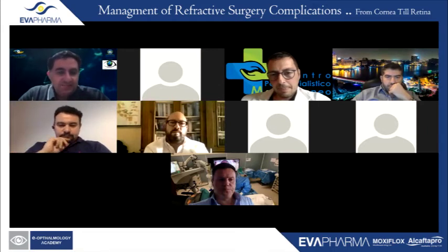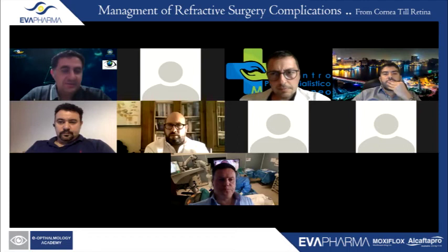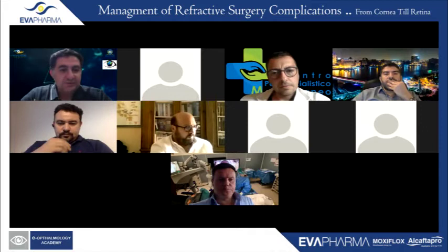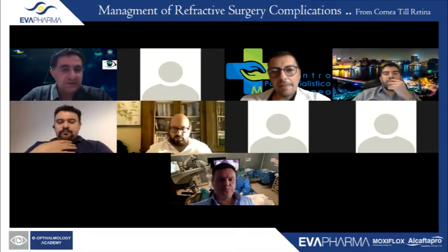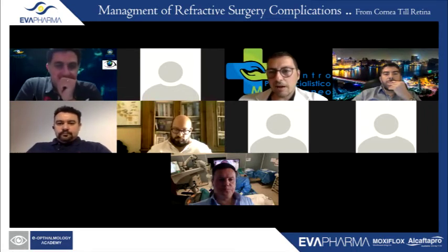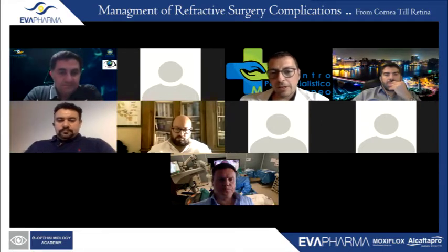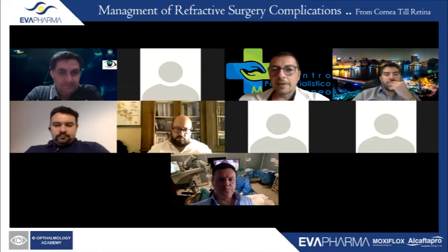Do you feel a change in the results postoperatively? When you do a manual removal with the alcohol, the PRK, and the trans-PRK or the SmartSurf light, do you feel any difference in the outcome? Yes. The patient satisfaction, the patient pain, and why? Absolutely different. In normal cases, now I just perform trans-PRK. I really abandoned the alcohol for a lot of reasons. If the patient moves, we have a lot of inflammation because the alcohol goes everywhere. The epithelium and also the stroma suffer.